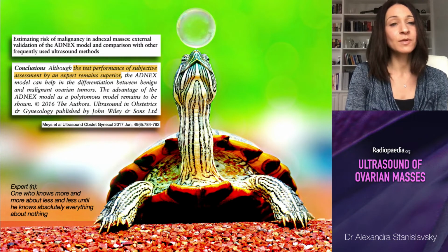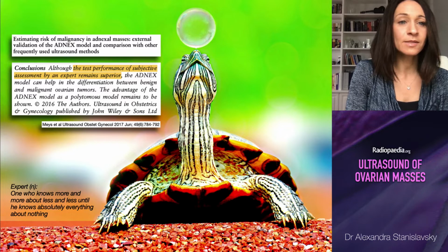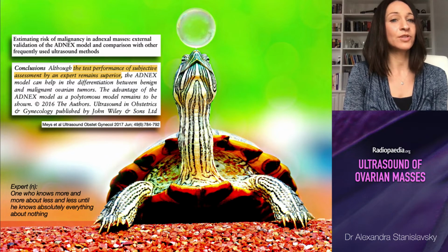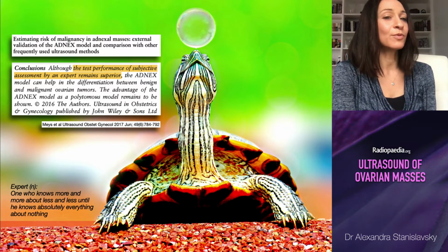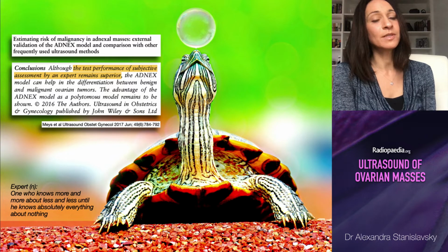But of particular interest to me was this phrase in the conclusion that although the test performance of subjective assessment by an expert remains superior, the ADNEX model can help with differentiation between benign and malignant. So the subjective assessment by an expert remains superior. And this is an interesting point where, whilst we're talking a lot about how these systems might help us in the diagnosis, it's nice to hear that perhaps what we also need to be doing is just knowing our stuff.